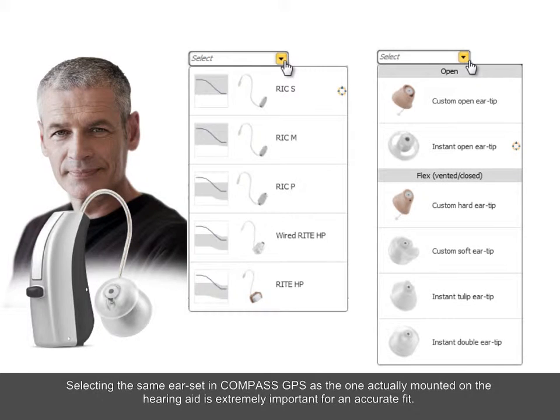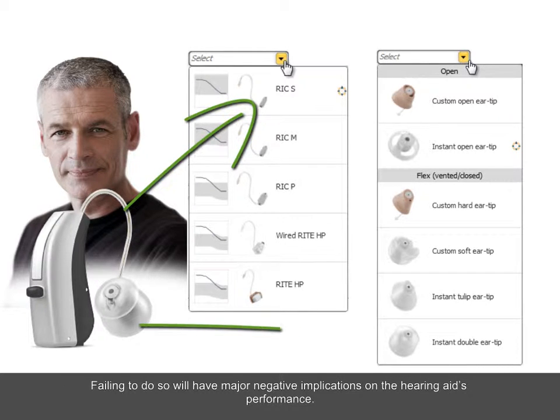Selecting the same ear set in Compass GPS as the one actually mounted on the hearing aid is extremely important for an accurate fit. Failing to do so will have major negative implications on the hearing aid's performance.